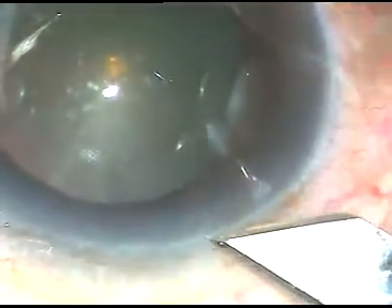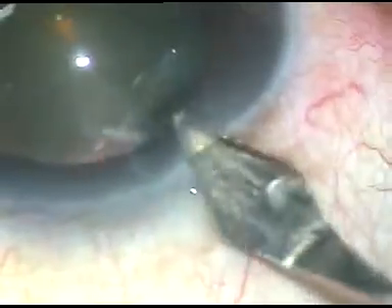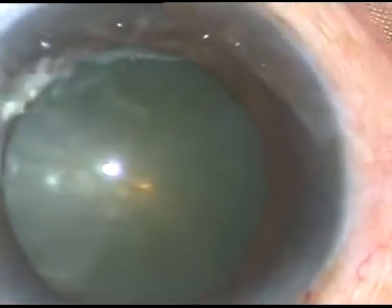This is a no-hydro-phaco, which means hydro-dissection — which is routinely done after capsulorhexis — has not been done in this case. Let us see the surgical steps. The main incision has been made and this is Viscoat from Alcon. Underneath this Viscoat, HPMC is being used so that the Viscoat goes upward and sticks to the corneal endothelium. This is the modified soft shell technique.